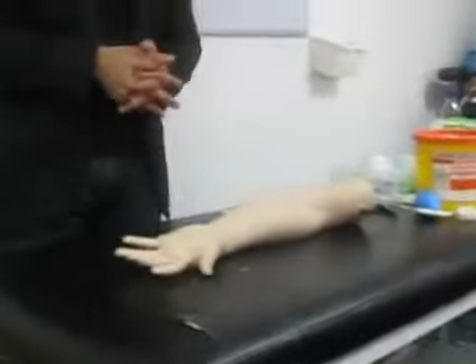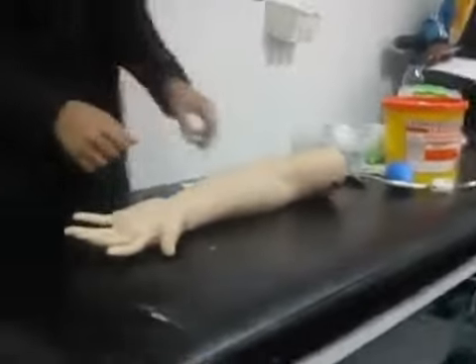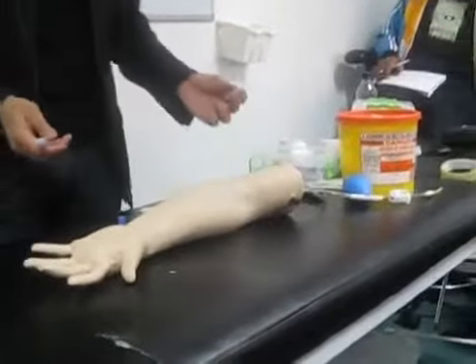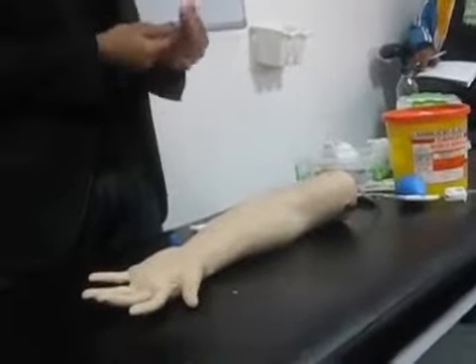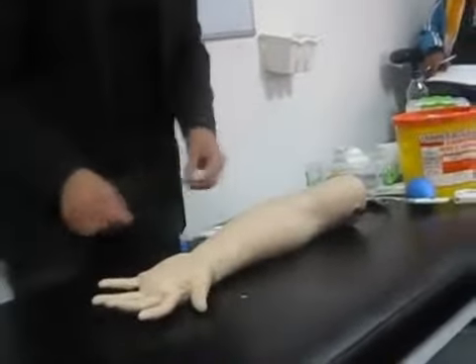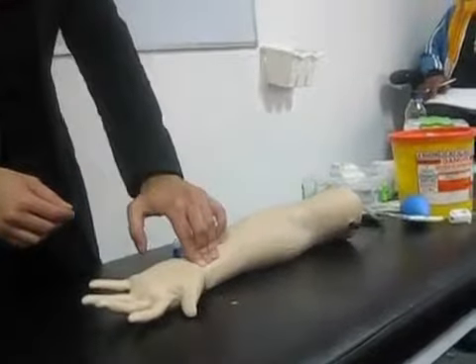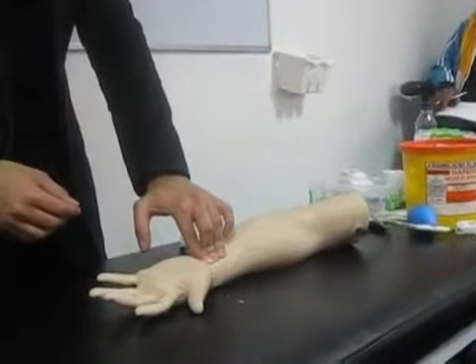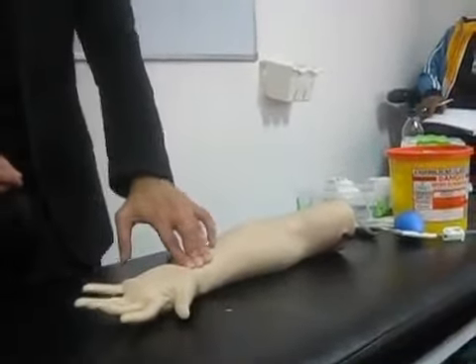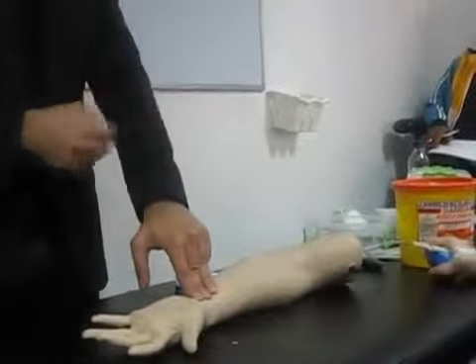May I know, please, where my clean area is? This is your clean area. Right, thank you. Can I please have a bubble remover? Right, thank you. I cannot appreciate the radial pulse. Okay, thank you.